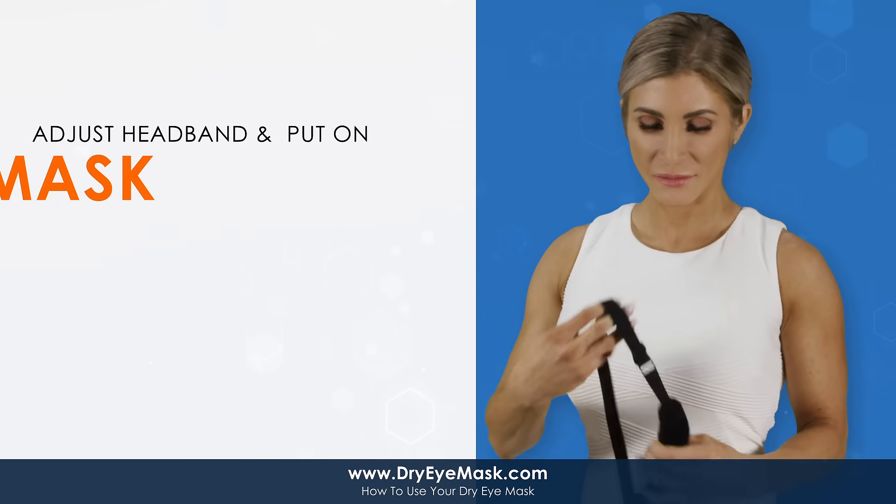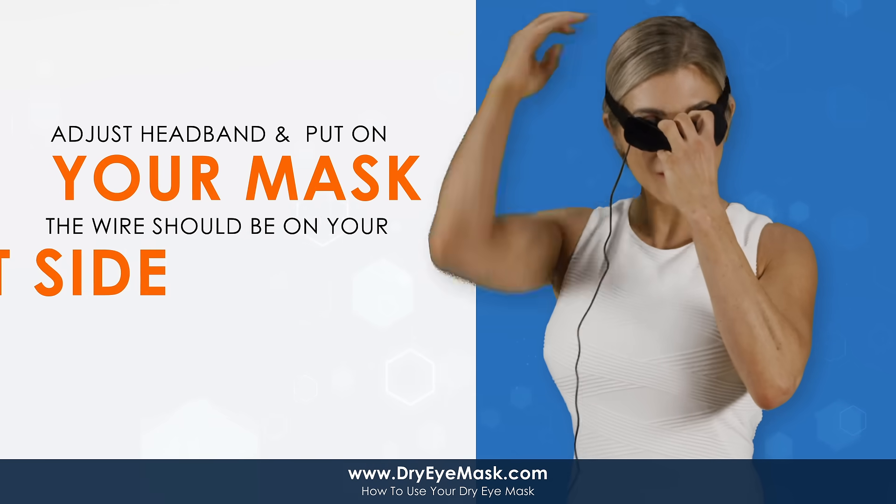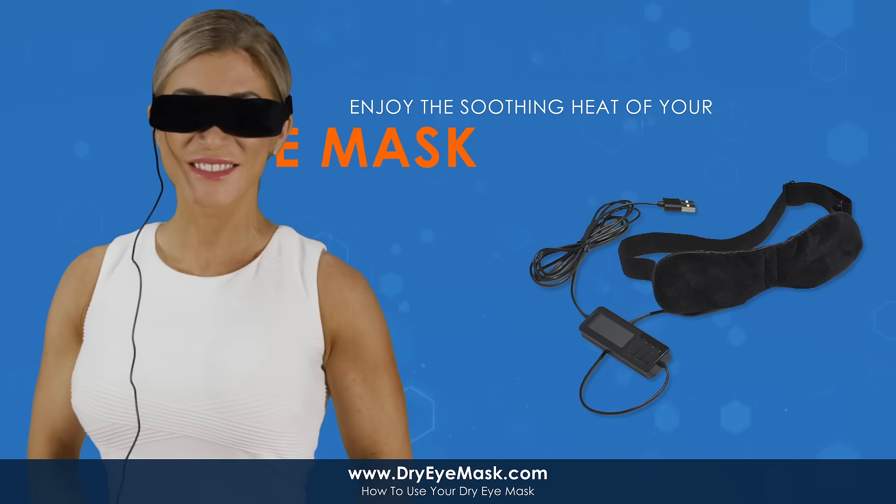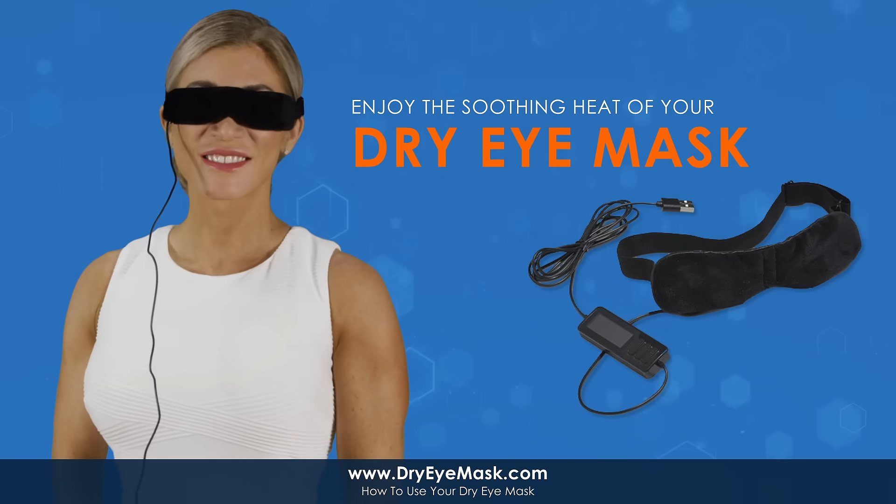Adjust the headband and simply put on your mask. The wire should be on your right side. Enjoy the soothing heat while the mask brings you dry eye relief.